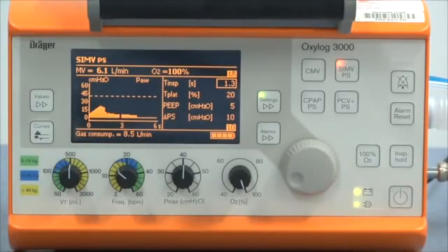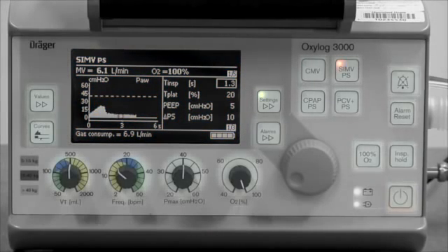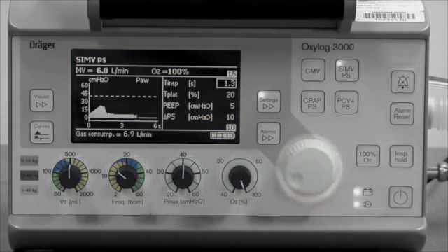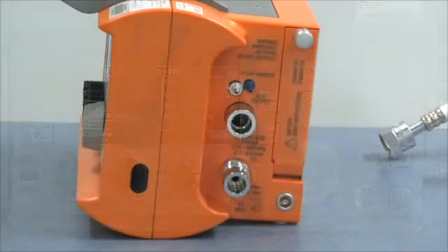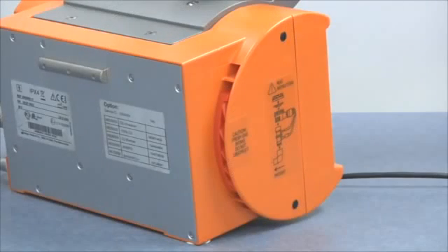The front panel of the ventilator consists of a screen, keys, parameter controls, and a rotary knob. The right side of the ventilator has connections for DC power, the oxygen supply, ventilator hose, and flow sensor hoses. It also has a slot for the battery. The left side has slits for air intake when using combined oxygen-air mixtures.